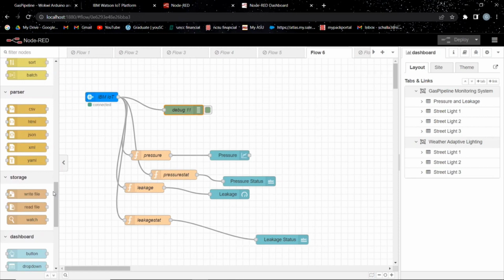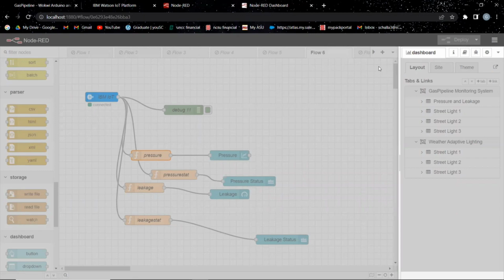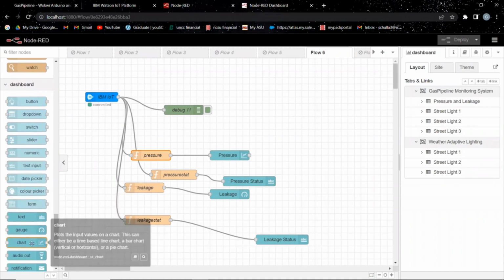So coming to the pressure, one function is pressure. So click on pressure. It simply shows the pressure values in the form of a visual representation tool like a chart or a bar graph, etc. So you will have to define the payload as message.payload.pressure. We are attaching the pressure value to it, and then you are returning the message. So click on done. Then select the appropriate visual representation tool from the dashboards. Here we are selecting a line chart. So click on chart, and here we'll drag it and add it here.